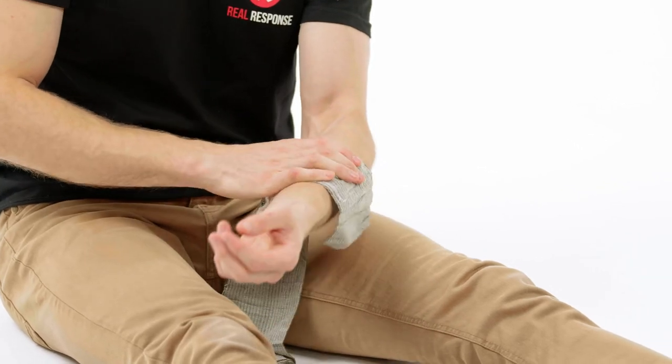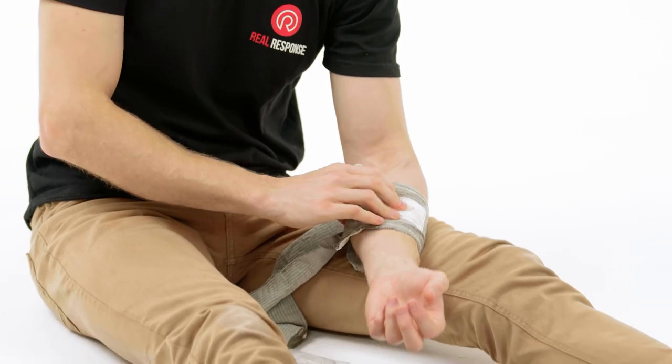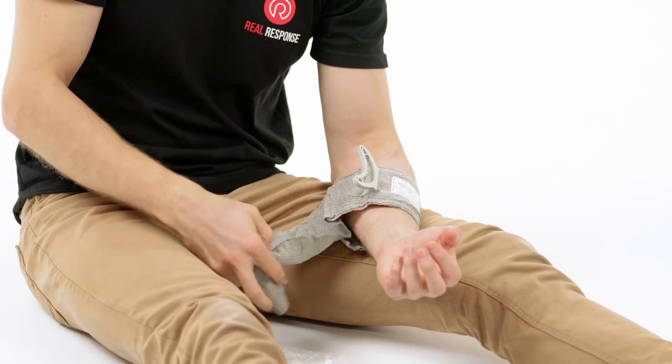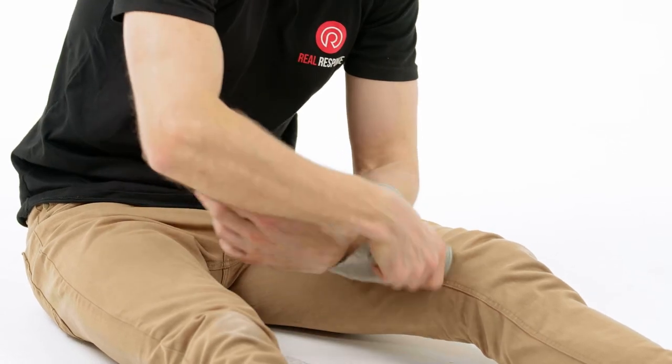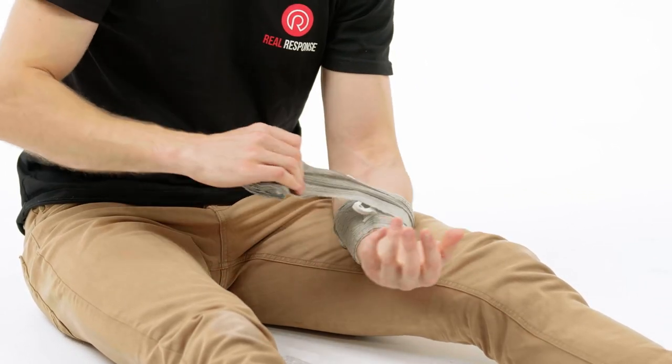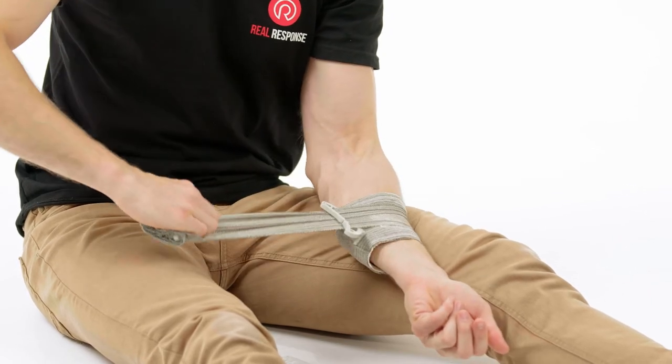Once it's out of its package, you then want to place the bandage straight over the wound itself, ensuring the pad is putting pressure on top of the wound. Once you've done that, you then want to anchor the bandage, ensuring that it doesn't slip, because this can be the part where it's difficult to apply.